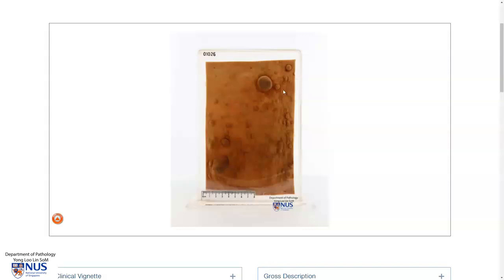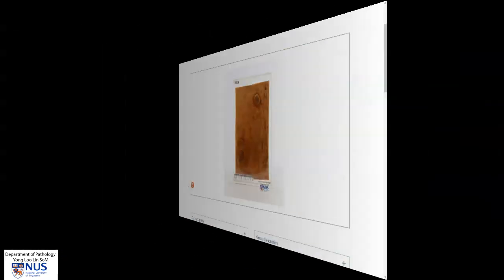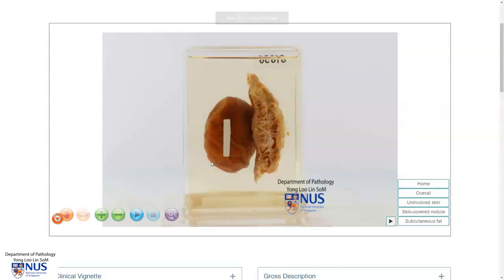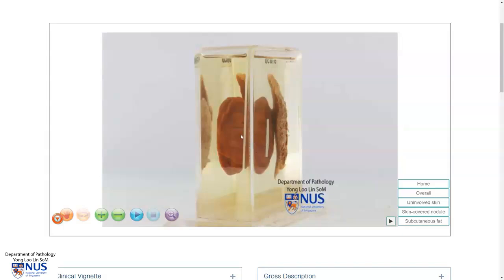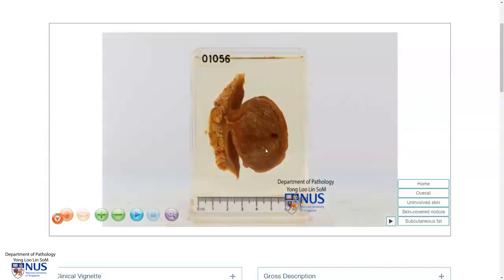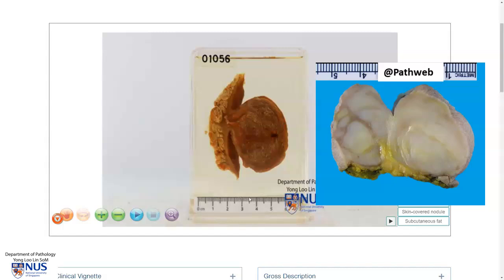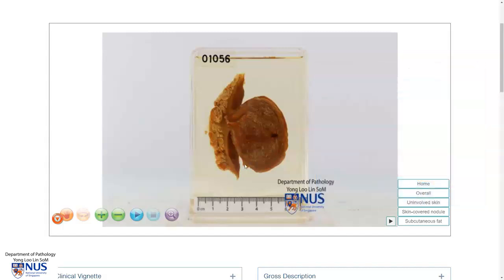These lesions protrude from the skin surface. In summary, this is a neurofibroma — a skin-covered nodule where the overlying skin is intact. There is a yellowish-appearing nodule deep to the epidermis; in the fresh specimen this would appear glistening and whitish. This is a benign tumour; however, there is a risk of malignant transformation over time in the instance of very large diffuse neurofibromas or plexiform neurofibromas, which are associated with neurofibromatosis. Thank you.